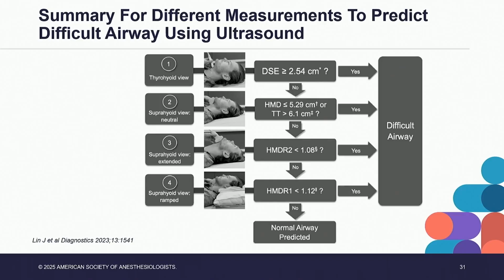And if no, that means that you have a normal airway predicted. So if you can combine that, you can have a very good view of how you can predict difficult intubation using ultrasound.